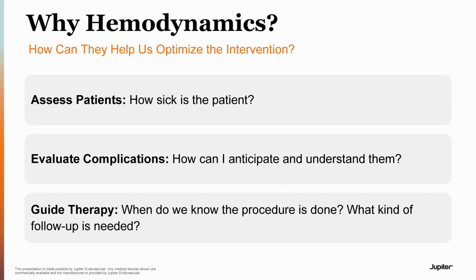Thanks for the opportunity. I think this is a great session so far. We talked a lot already about the invasive hemodynamic assessment of these patients in the cath lab before, during, and after the procedure. And what is the role of all this? Why are we doing all this? It's multi-layer, right? We need to assess how sick these patients are, and we've already seen that in Sripal's case. It's also very useful in evaluating complications. When something happens in the case that doesn't go in the right direction, assessing hemodynamics may help you understand what's going on and ultimately guide therapy, which is what we're talking about.